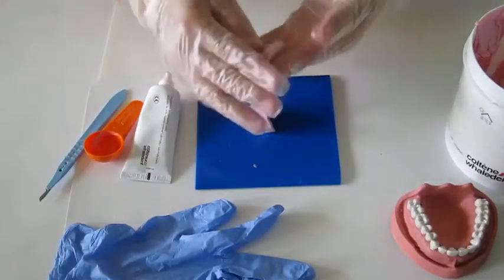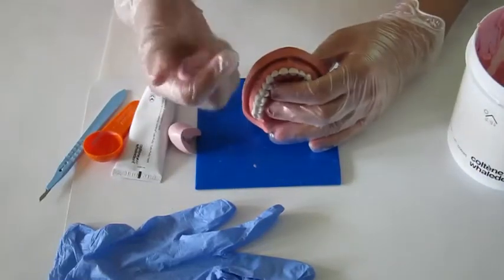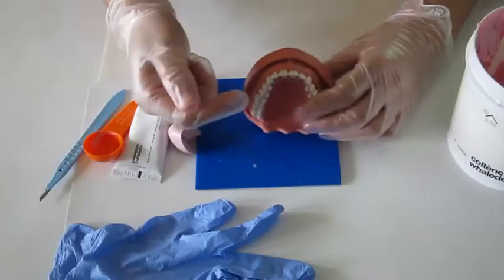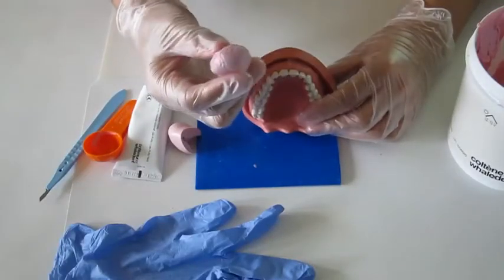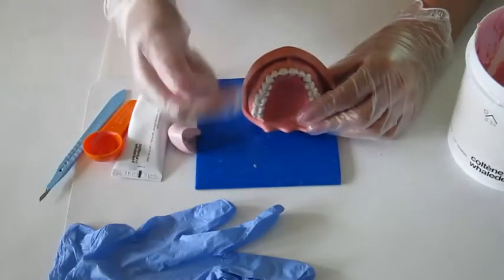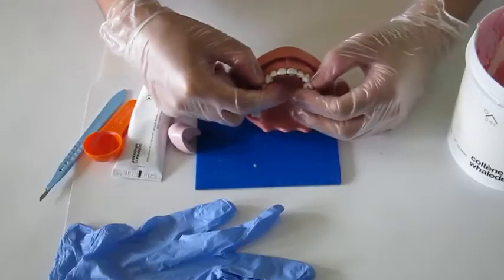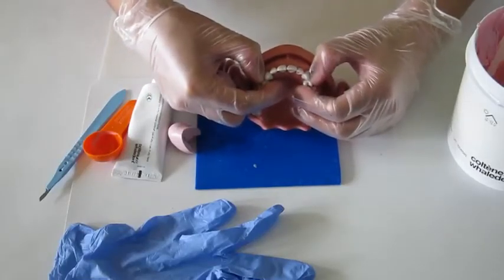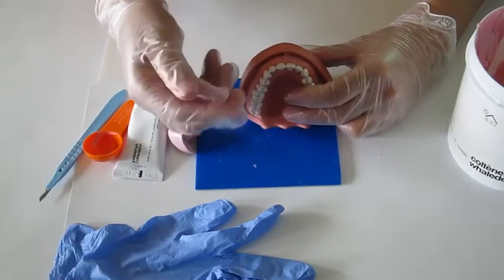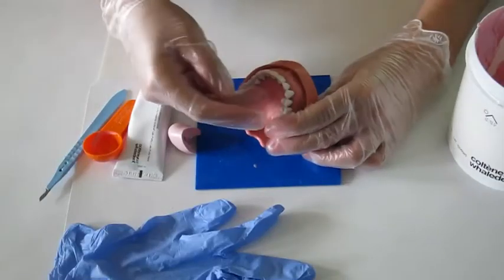After 30 seconds, the material is well mixed. I will put the putty onto the targeted tooth — today we will make the preparation on tooth 11. Normally, it's not necessary to extend the putty too far from the target tooth. For a single restoration, just extend the putty to the adjacent two or three teeth on both sides. The width of the index today is from canine to canine, and the index should be 8 to 10 mm away from the gum line on both the facial and palatal sides.